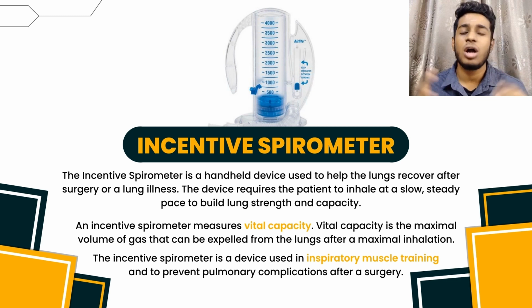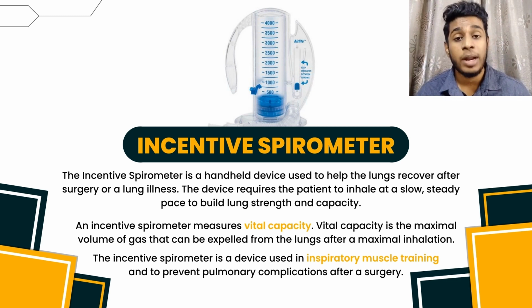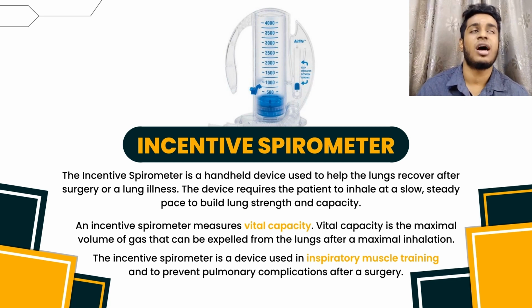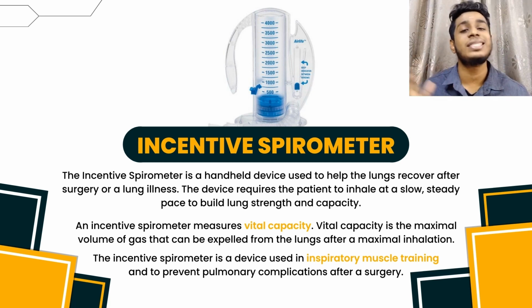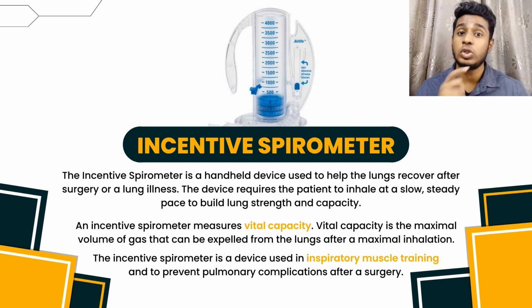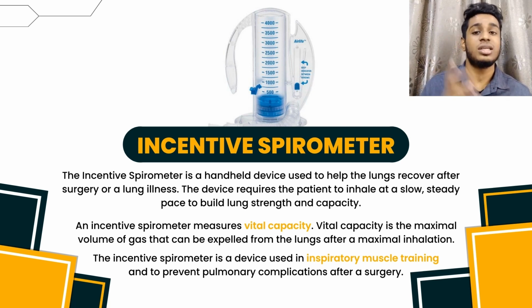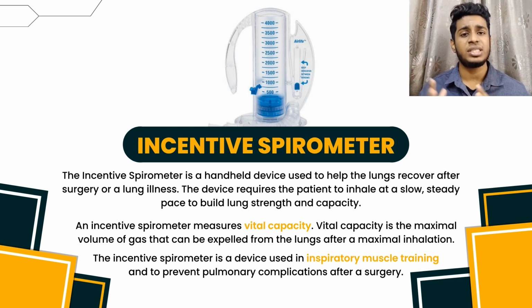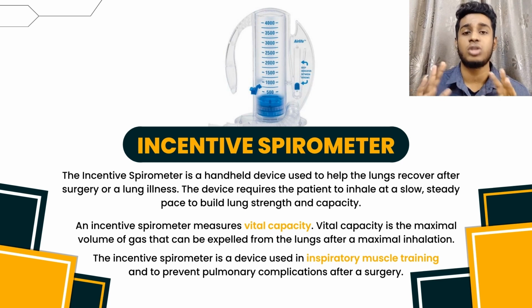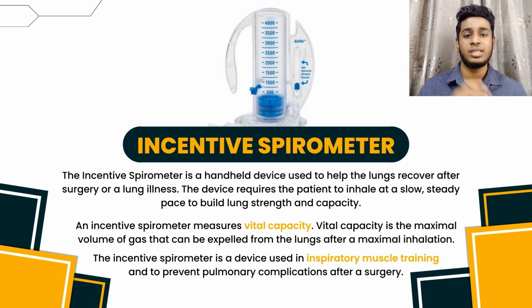Now I want to talk about the incentive spirometer. Spirometers are commonly used at a hospital after surgeries or prolonged illness that lead to extended bed rest. The incentive spirometer is a handheld medical device used to help the lungs recover after a surgery or lung illness. The device requires the patient to inhale at a slow, steady pace to build lung strength and capacity.